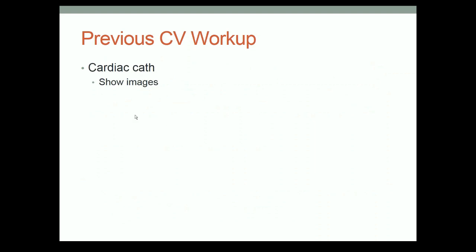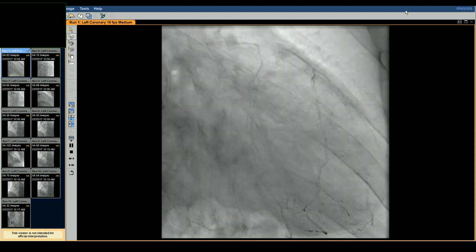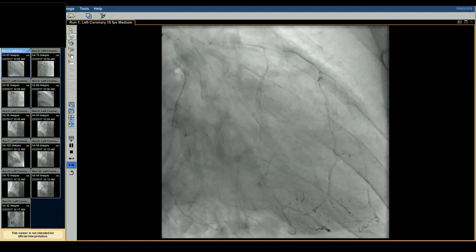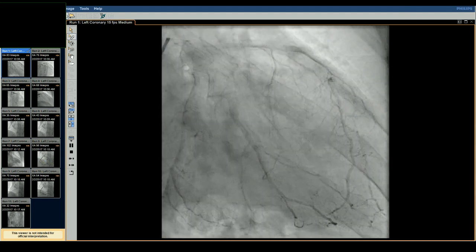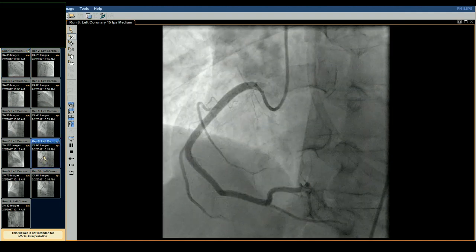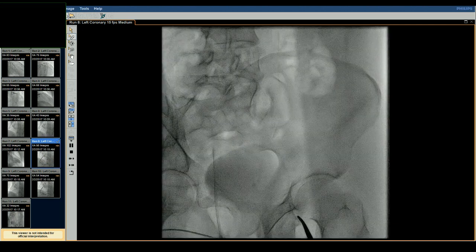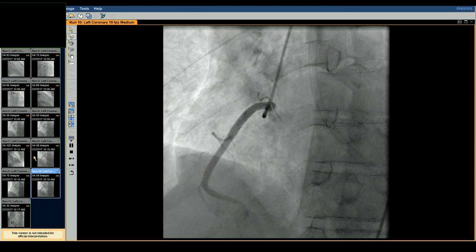And of course, it's inevitable. I'm not sure why he didn't get a cath earlier. It's inevitable that he would get a cath, showing up with these symptoms going back so long with such chronicity. So here's a coronary angiogram that shows normal coronaries. Looking pretty good. LAD distribution is pretty normal. Right coronary looks great. Nothing else seen.